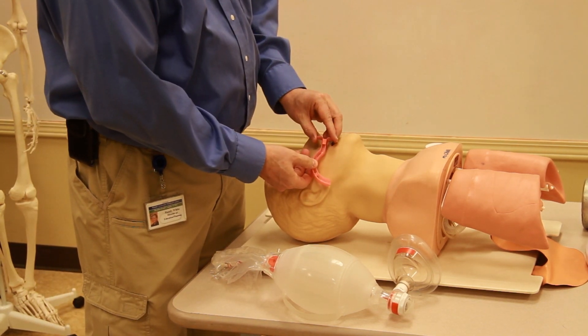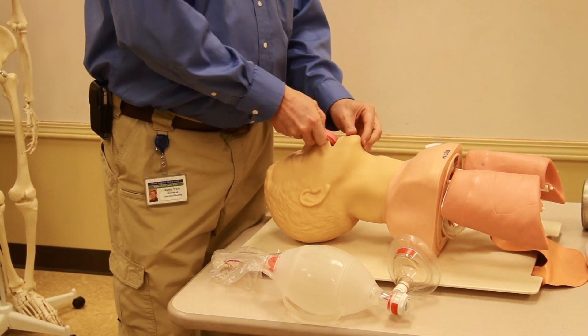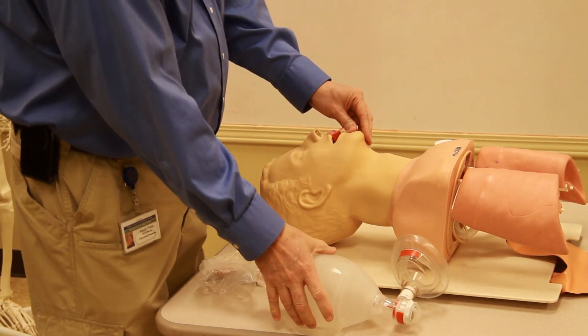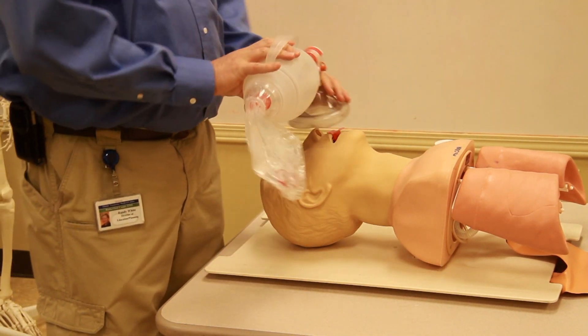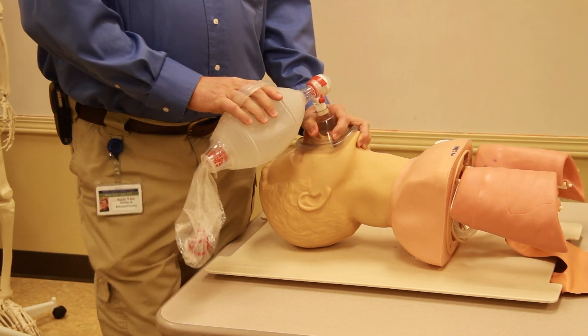We're going to insert the oropharyngeal airway. We measure it off, then go in upside down until we meet the hard palate, then twist as we go down. Then we ventilate the patient.